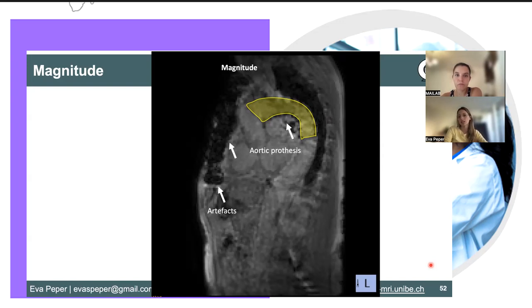But in general, it is actually very well possible at many different field strengths, especially because you're always looking at, let's say, a phase difference image. That makes it a long scan, but this phase difference will already correct for a lot of phase effects that you might encounter due to, I don't know, inhomogeneities or whatsoever. So it's a nice thing.